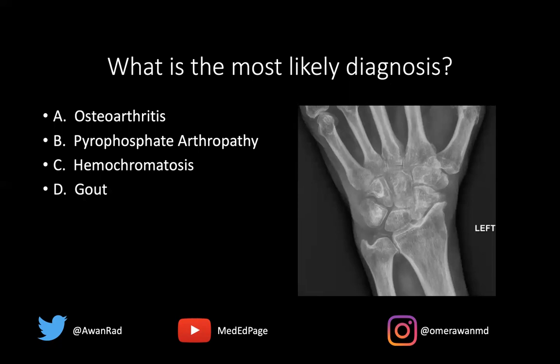First, it's important to understand that we have some chondrocalcinosis. We can see calcification outlining the TFCC — the triangular fibrocartilaginous complex — right here, and also chondrocalcinosis within the lunotriquetral ligament. That finding alone is not diagnostic of any particular entity; all four of these entities — osteoarthritis, pyrophosphate arthropathy, hemochromatosis, and gout — can have chondrocalcinosis. So that leaves us somewhat stuck.